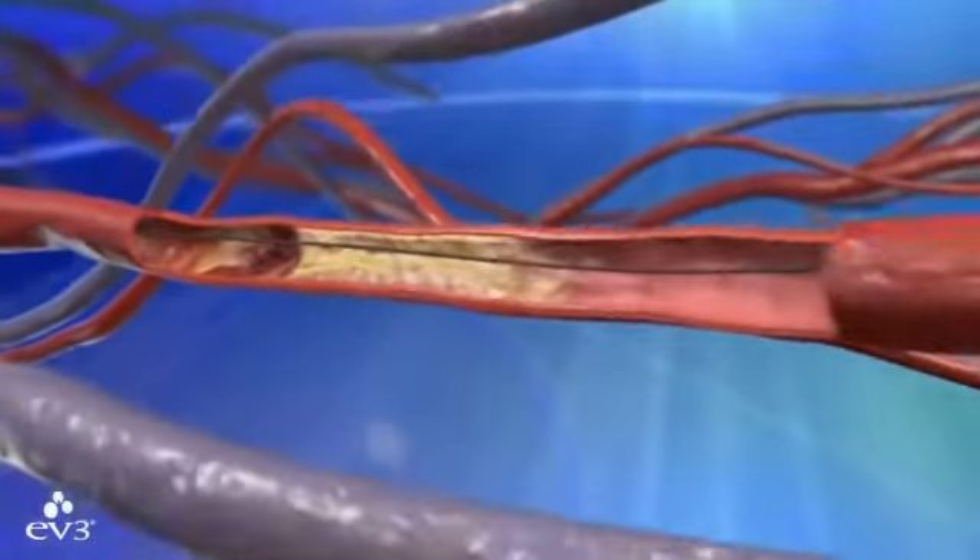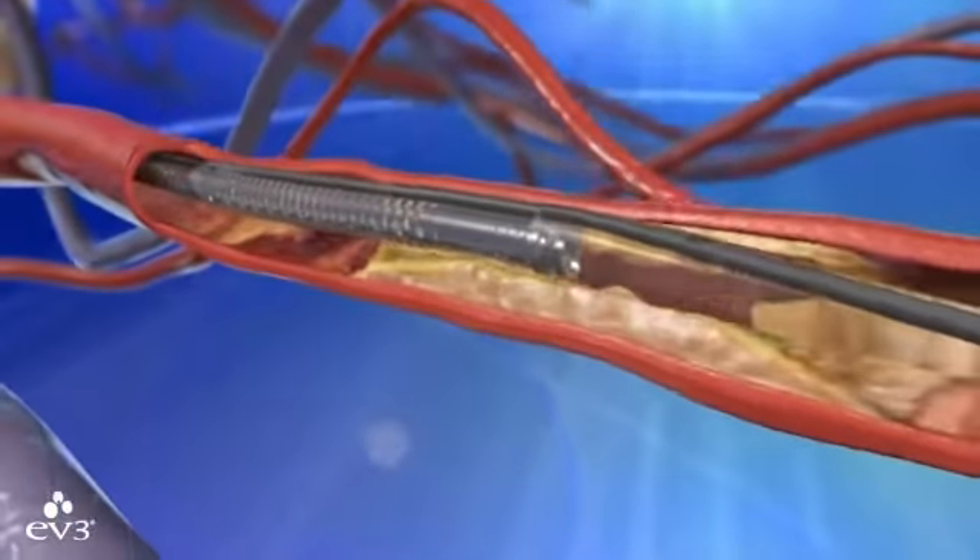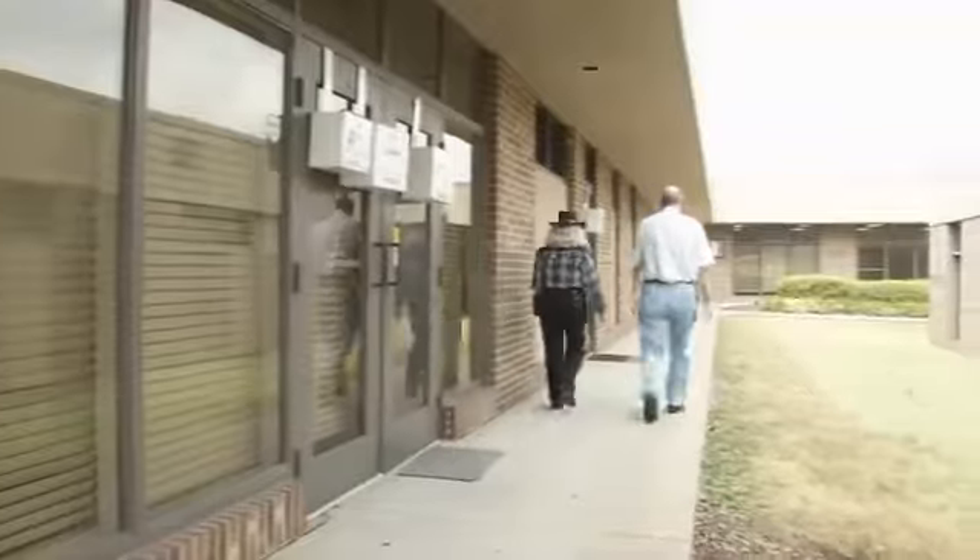Jimmy Wilkie called it a "roto-rooter" — but whatever you call it, TurboHawk or roto-rooter, he says the procedure worked right away. There wasn't any pain at all in the leg.